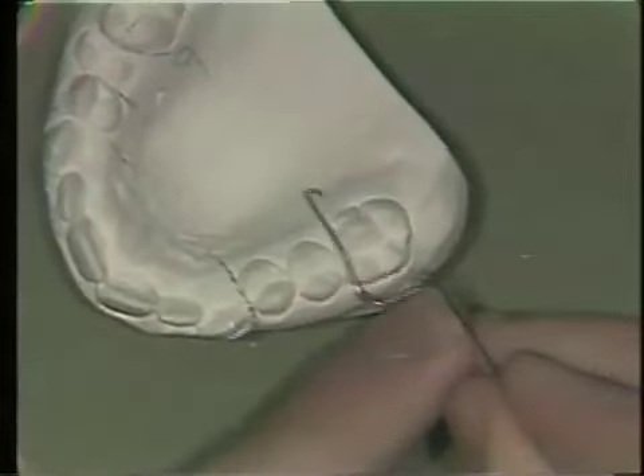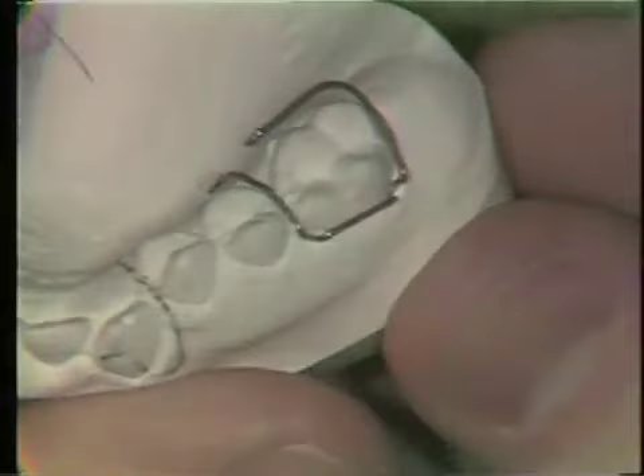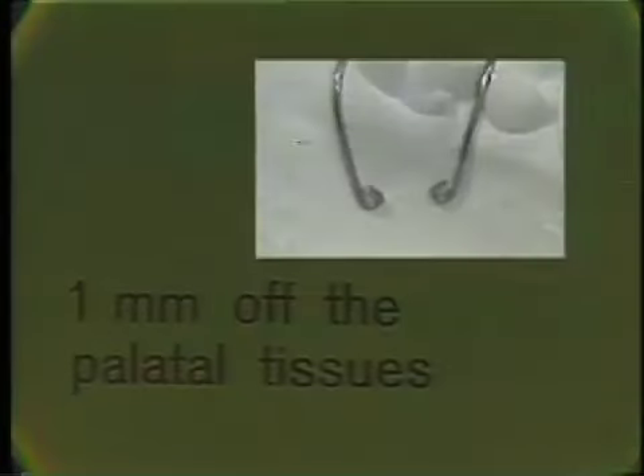The distal aspect of the spring is bent in exactly the same manner, adapting it through the proximal regions, closely adapted to the marginal ridges of the teeth. The criteria for a good Adams clasp: first, the loops must be in tight contact with the tooth in the undercut areas to ensure proper clasp action. Second, the wire must be closely adapted between the marginal ridges as it crosses the occlusion. And lastly, the wire must be one millimeter off the palatal tissues.